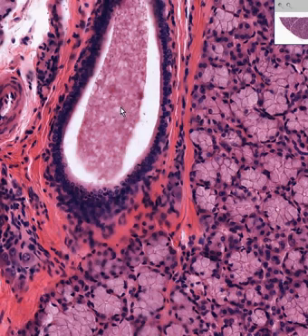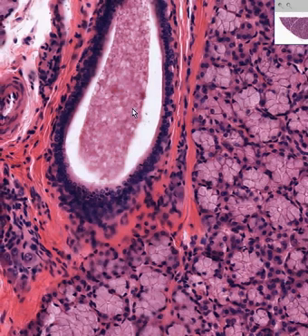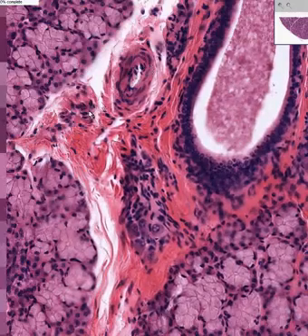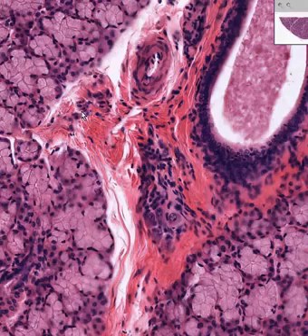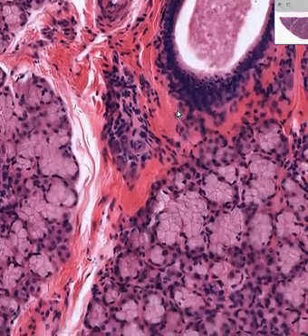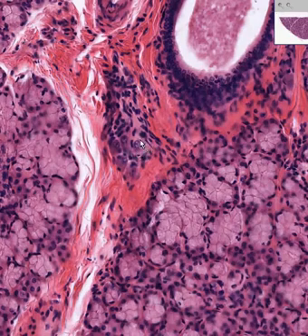And you know this is an arterial blood vessel. And you know this is simply connective tissue over here. And if you wanted to be really smart, I could probably tell you this has all the classical features of a plasma cell, in that the nucleus is round, it's off to the side, it has peripherally dispersed chromatin, and it has a little white area in the open area of the cytoplasm. These are the 4 or 5 classical features of a plasma cell.